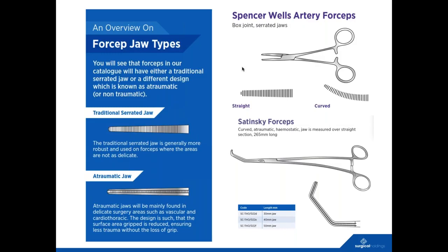Absolutely. And I'll go back to your thought on the inspection of the instruments. It's really, really important that these teeth are looked at very closely, particularly on artery clamps, where maybe through the process, if they've attained a burr or something like that, and we miss it, potentially that's something that could damage an artery. As opposed to being an atraumatic clamp, it becomes a traumatic clamp. So really, that inspection piece is very important, in understanding the different teeth and how they should look. Yeah, that's it. And checking for burrs, as you say, vital.